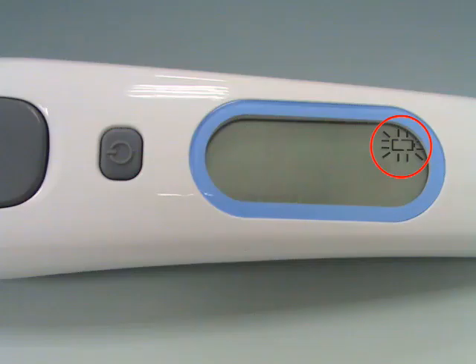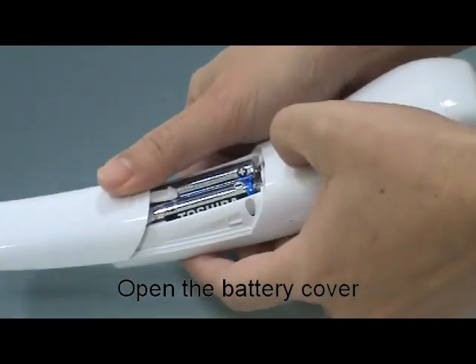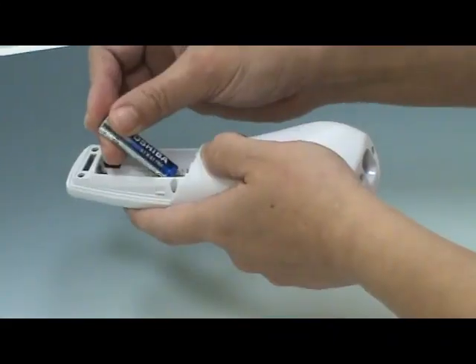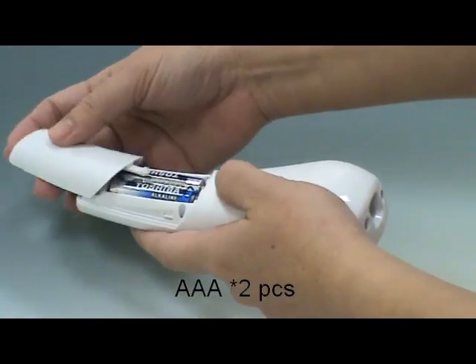When the low battery icon appears, please change the battery. Use your thumb to push the battery cover out. Hold the thermometer and take the batteries out. Insert the new batteries and replace the battery cover.